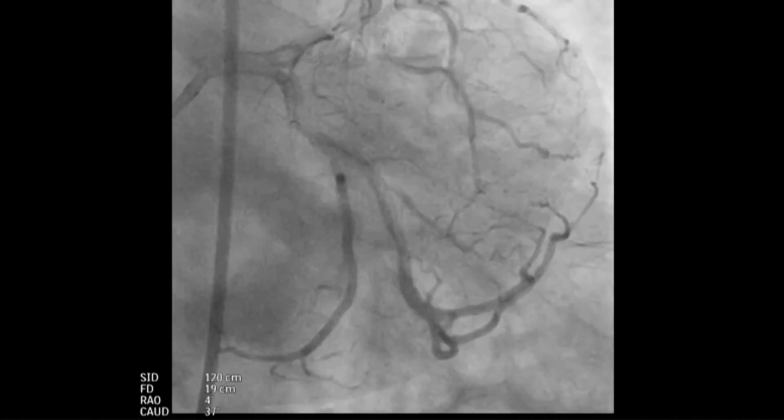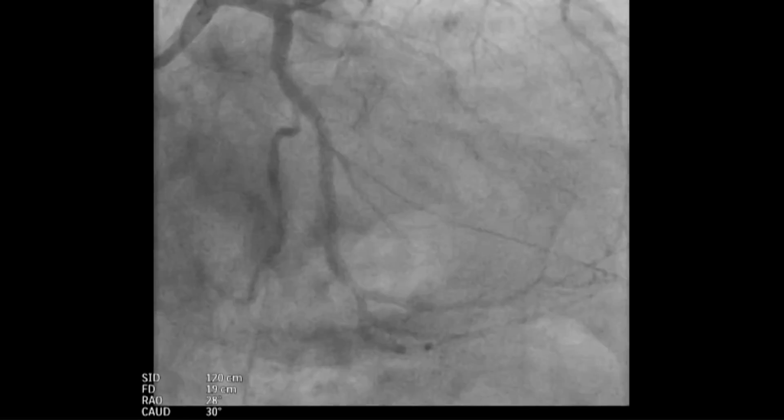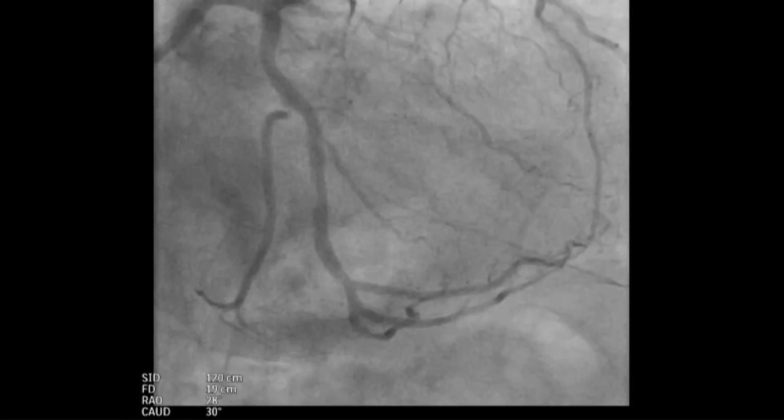Thanks for showing an interesting DK crush bifurcation case, even without the patient being there, and you did your best in the existing scenario.